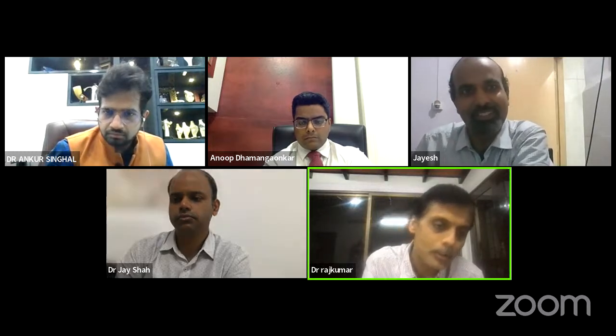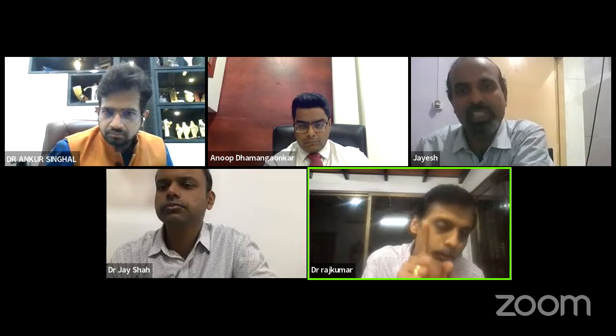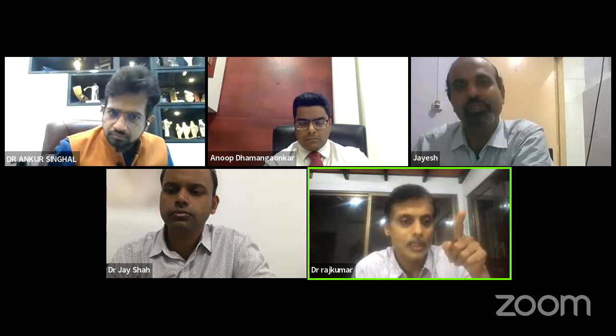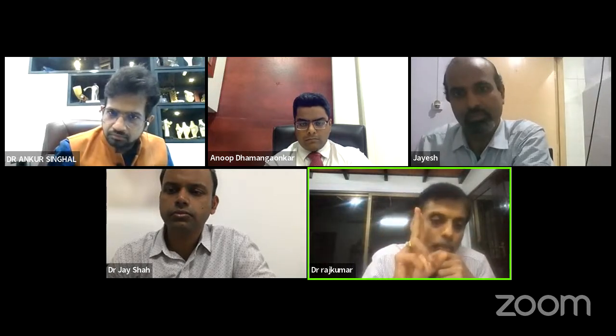This is almost similar to what I said now, like the pedestal. Once it is almost perforating one side, the other side is thick. That is like a pedestal, the other side. So always don't hesitate to use the C-arm. Whenever you are seeing a case like that and you are going for a THR, don't hesitate to have the C-arm inside, draped, ready.